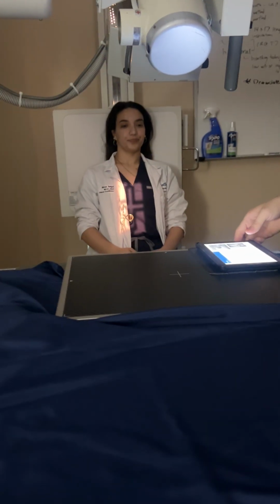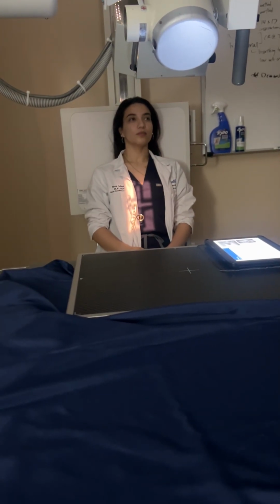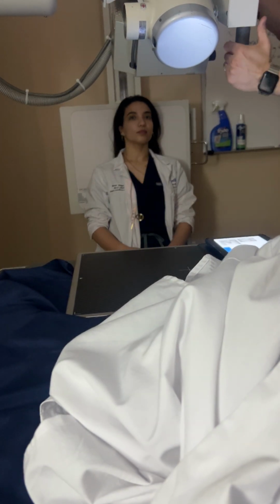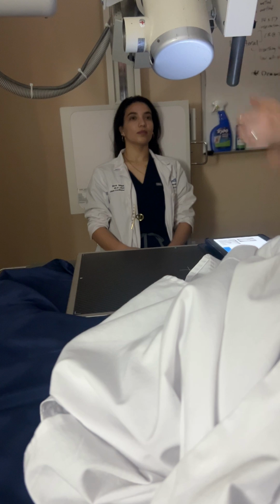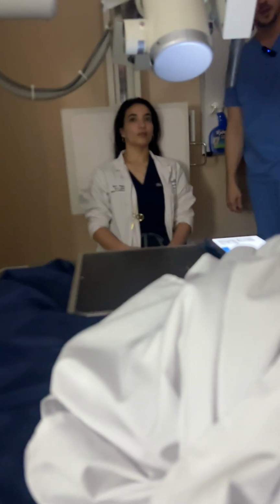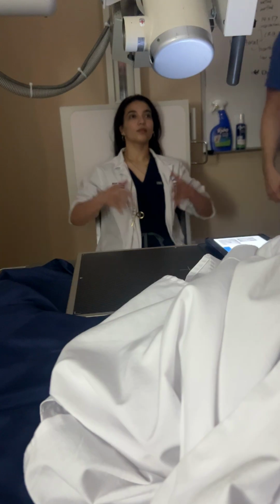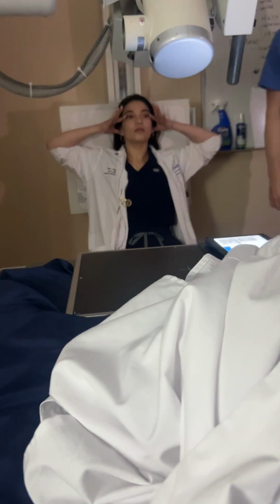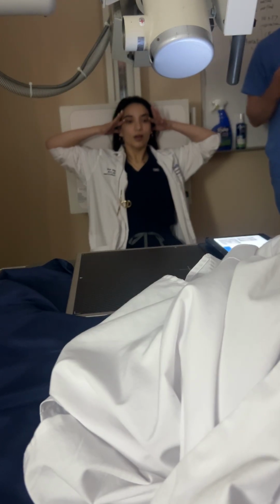Angulation for the AP axial Towne method is how much? Does anybody know? Angulation is 30 degrees caudad. Great. To what line? You said AP axial, is it the IOML? Oh, yeah. So two options for the AP axial Towne. If you use the OML, 30 degrees caudad angulation. If you use the IOML, 37 degrees caudad angulation. It depends on what your patient is able to do in terms of their comfort level.